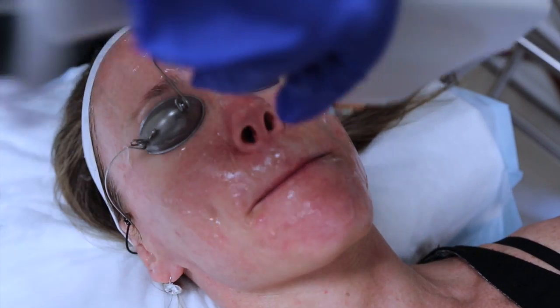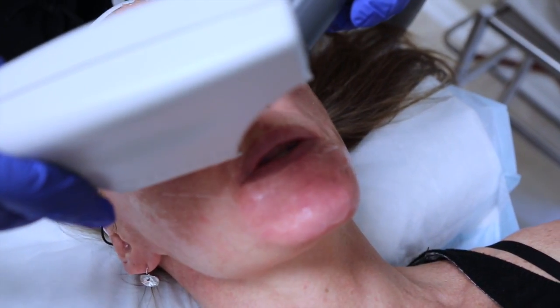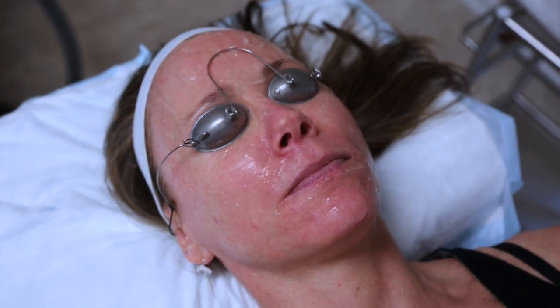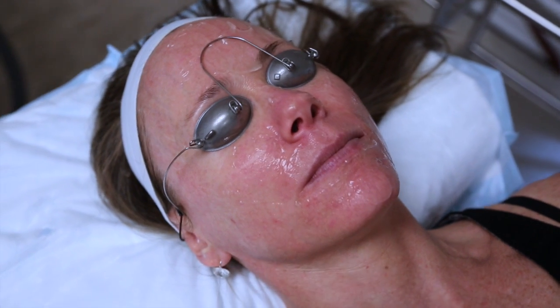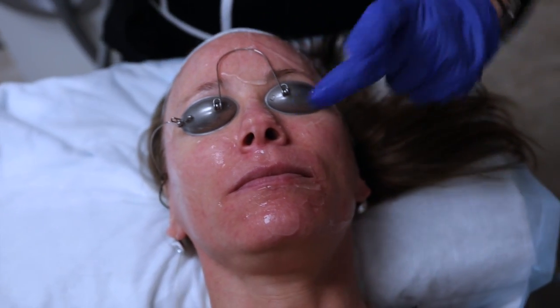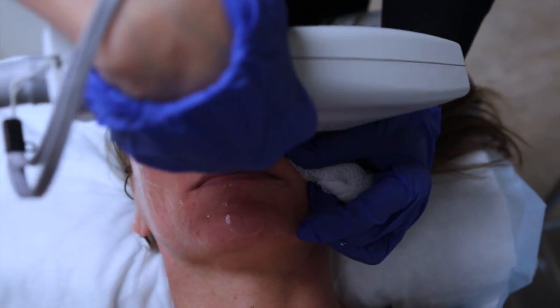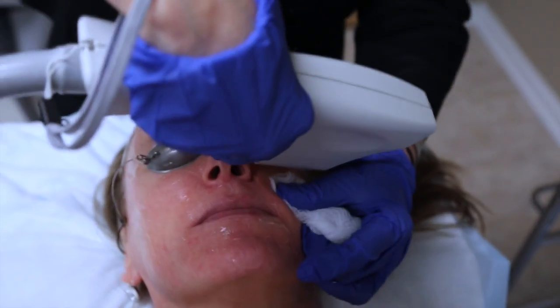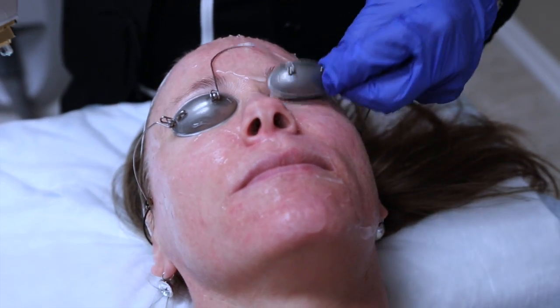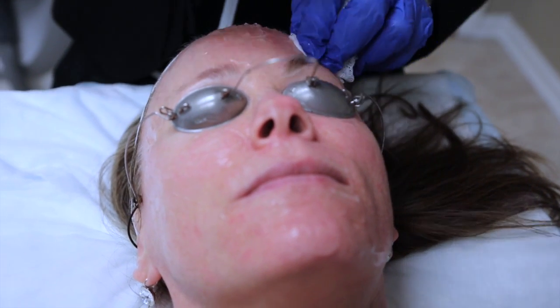Put your tongue under your upper lip. This wavelength also helps to kill some of the bacteria that causes acne. So patients who have a little bit of acne will find that after a BBL, their skin doesn't break out as much for a couple of days. So now, I don't like wrinkles, so what I'm doing is I'm treating close to the eye, to get some of the UV damage that happens under the eyebrow as well.